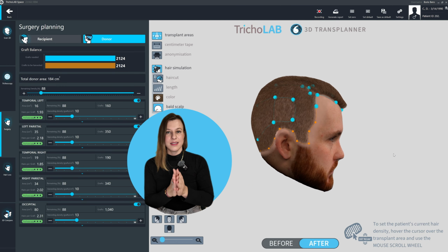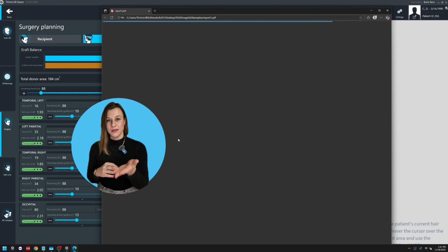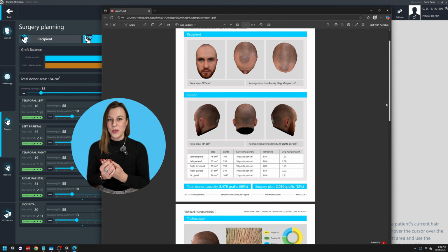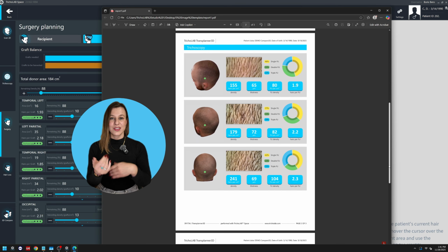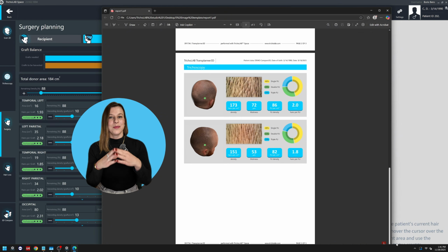This entire analysis is exported as a comprehensive PDF report. Your patient can receive it printed or digitally. You can also record the whole session and share the video with your patient. When we have the complete documentation, we offer complete transparency, and this becomes a part of their permanent medical record.